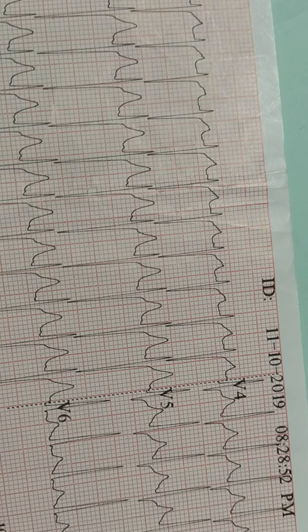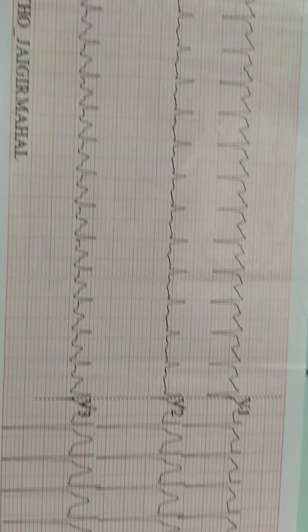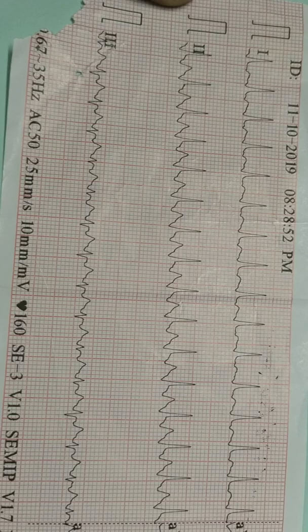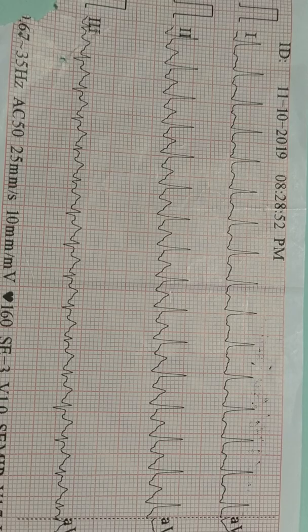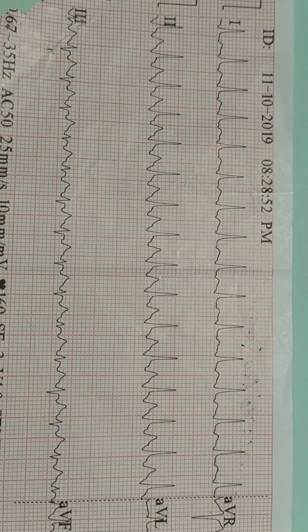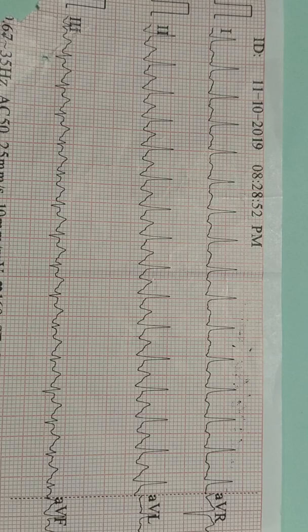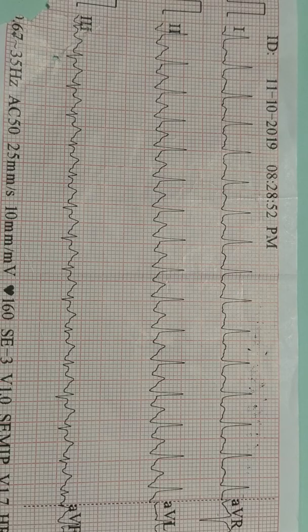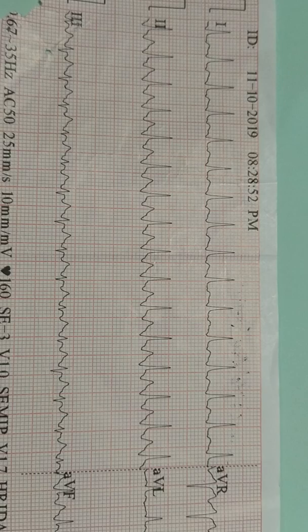This ECG is a case of supraventricular tachycardia. Why supraventricular tachycardia, and why not ventricular tachycardia? In ventricular tachycardia, P wave is absent, rhythm is regular tachycardia, but the QRS complex will be wide. In supraventricular tachycardia, the only difference is that the QRS complexes are narrow — it is called narrow complex tachycardia.